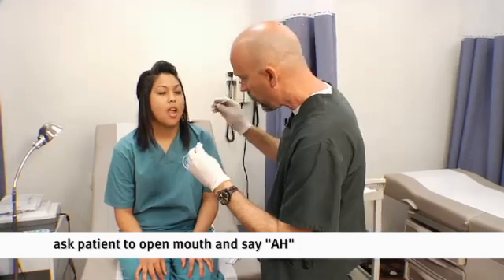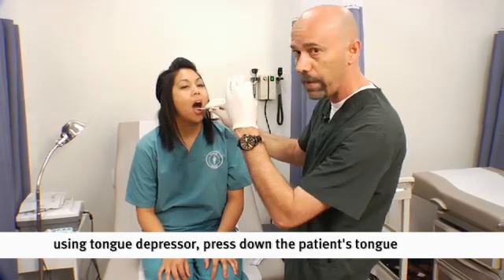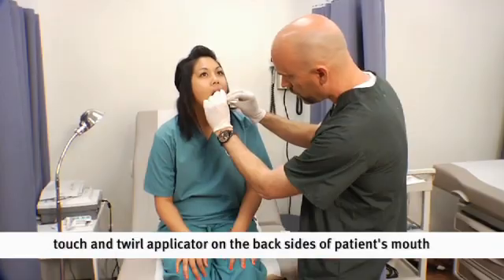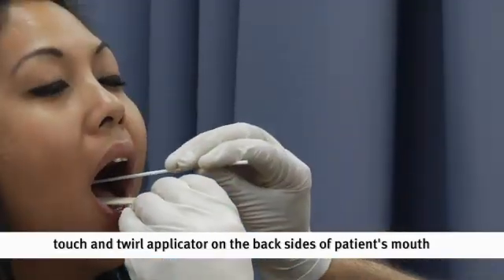Get as far back as you can with the swabs, which immediately causes them to gag. So it may take a couple times to swab, but as long as you can get a good swab and hit the areas that are really red or white, then you can usually get a pretty good positive test. Okay, we have the patient open up and say ah. And while she's saying ah, we're going to push down on the tongue, which actually lifts the back of the throat and tonsils and gives you a better view. Then on each side of the throat, we're going to touch and twirl the applicator to get our sample. You swab the back of the throat, which is actually the tonsils.